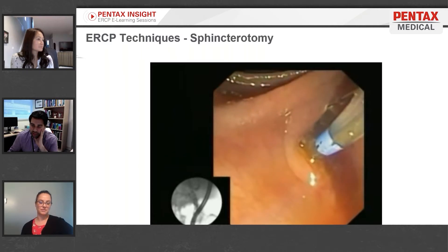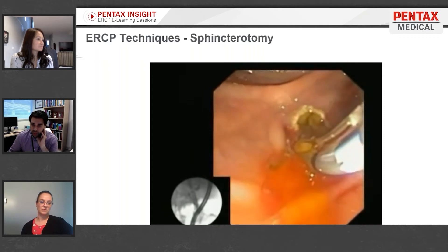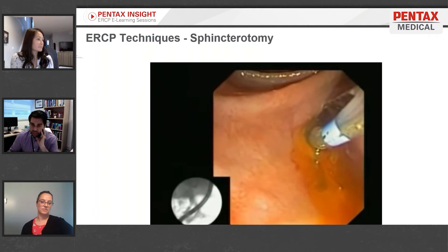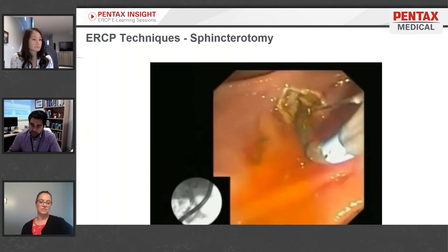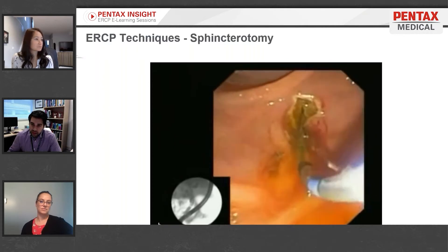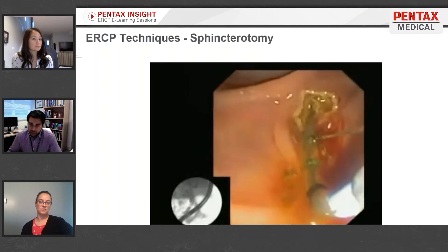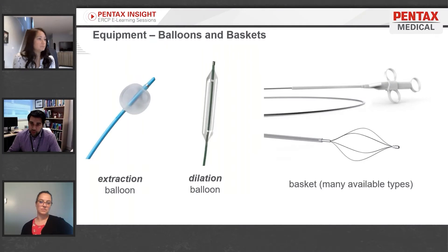The tome with the cutting wire is held nice and stiff, and they're doing what's called de-roofing the papilla — breaking down the muscle of the sphincter that controls that opening. The reason is that there are large stones inside, and to achieve drainage of the contrast you need to open things up. This obviously exposes you to risks: pancreatitis, bleeding — the higher you go the more bleeding you can get — and if you go too far you can perforate through the bowel wall.